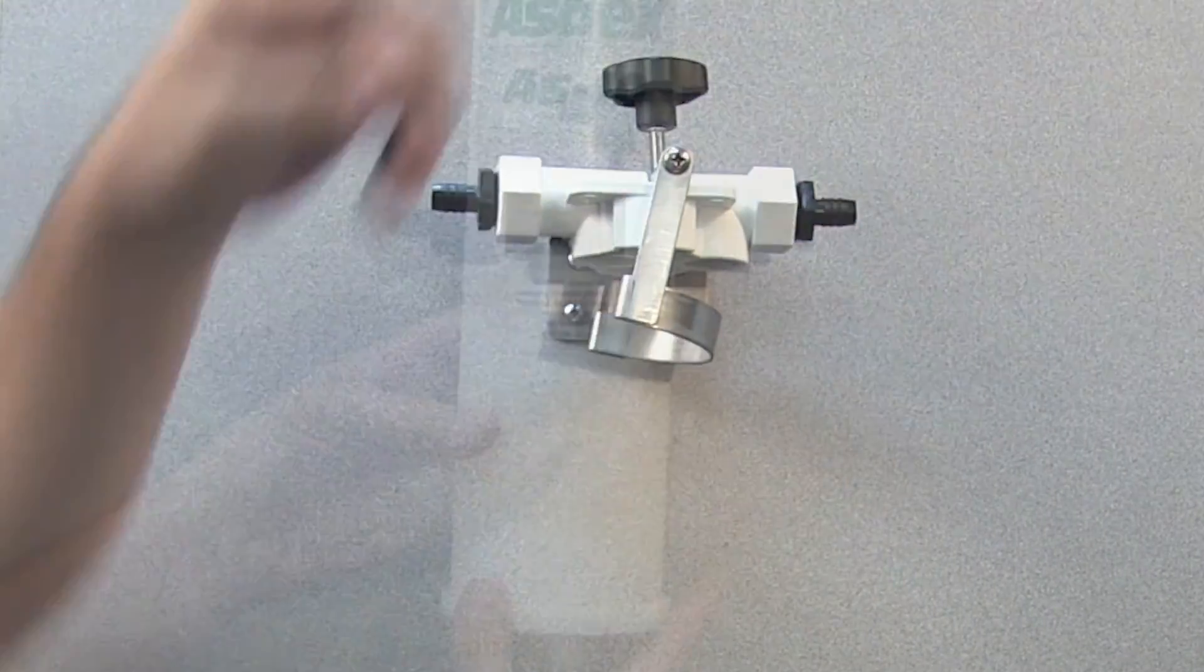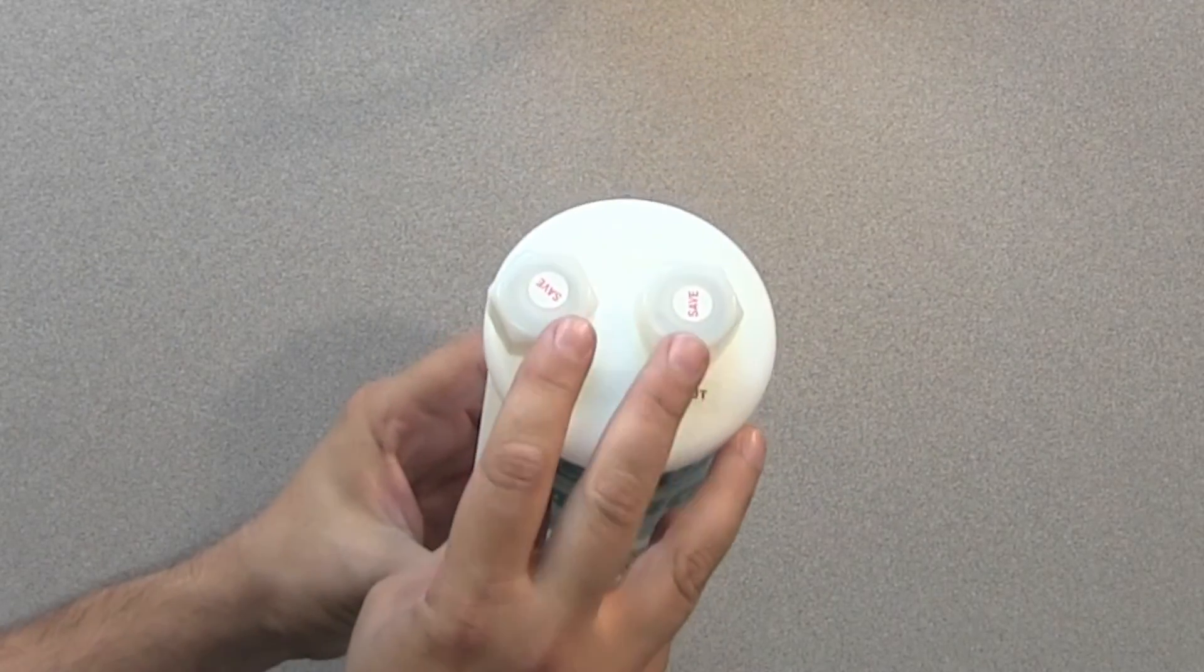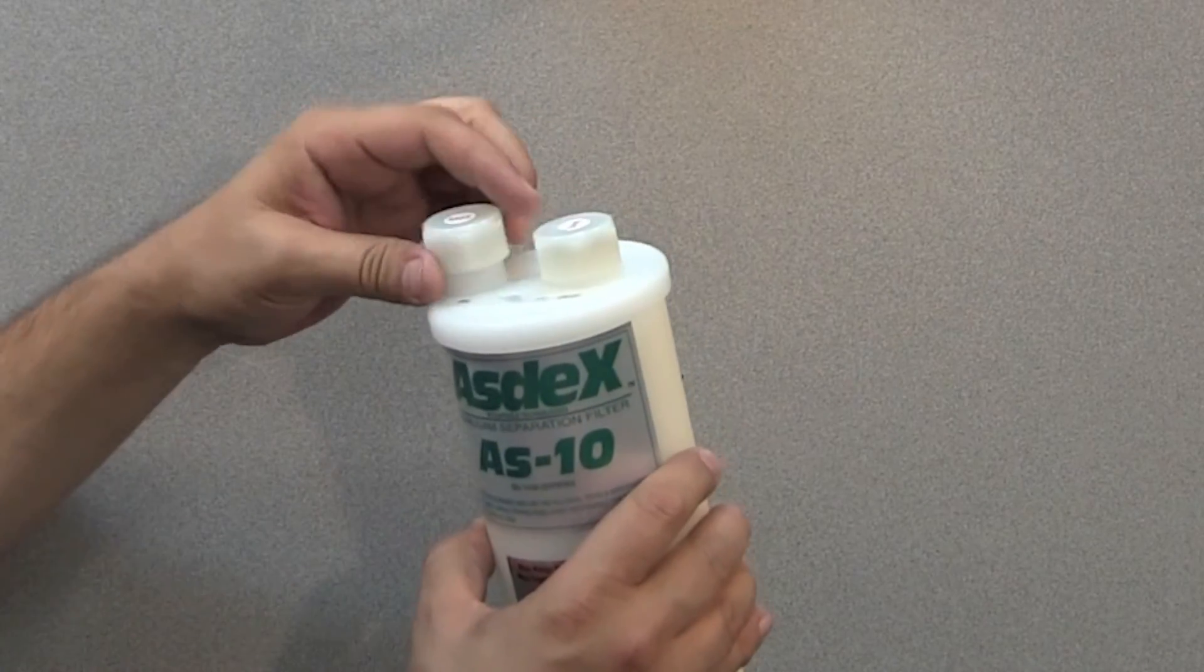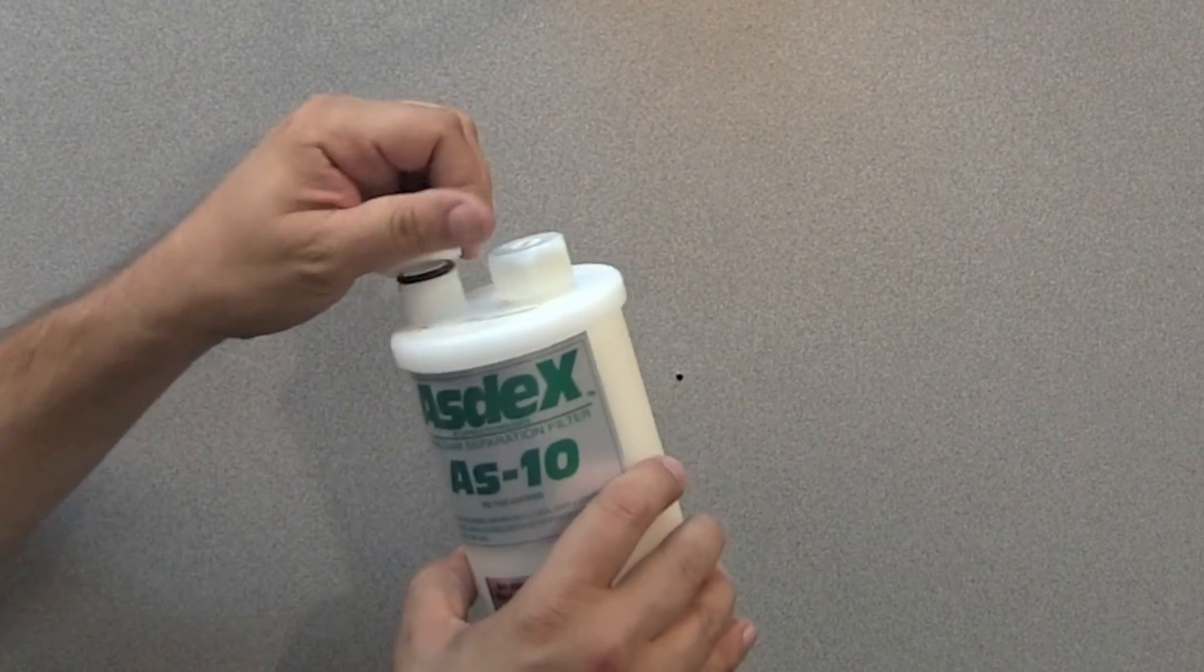Now, grab the separation filter and remove the inlet and outlet screw on caps. Keep the caps in a safe spot as you'll need them to dispose of the filter.